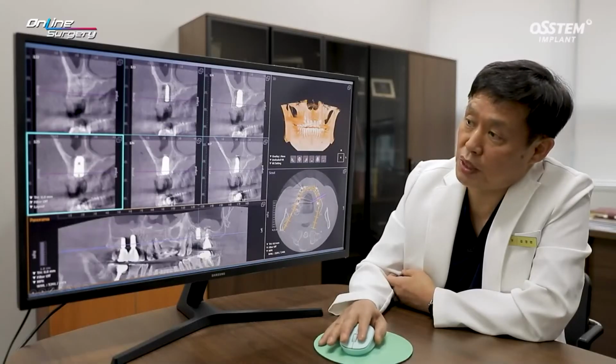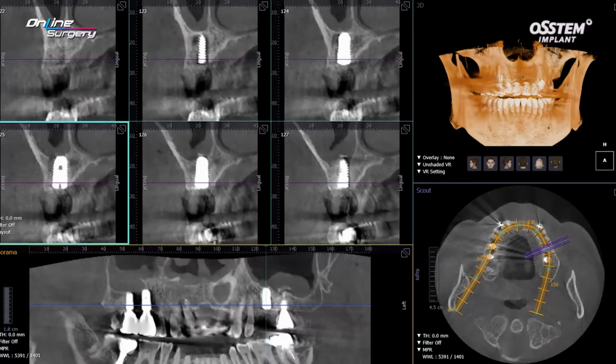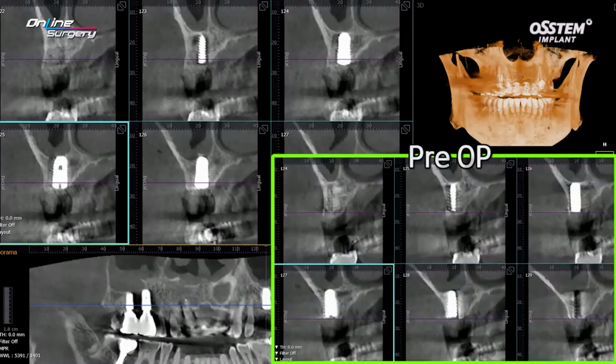In the post-op image, you can see that there's a space in the buccal area. I did not damage the buccal plate, and therefore I used autogenous bone graft materials to do bone graft. In the case of the fractured implant, you can see over here the buccal plate is still there.